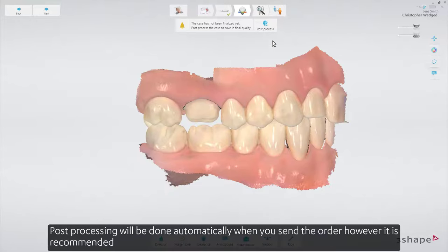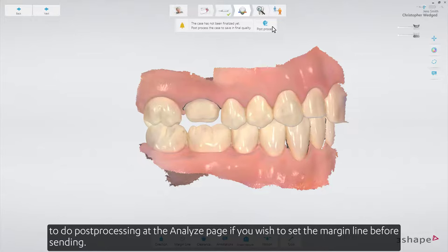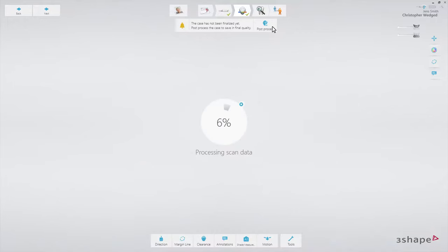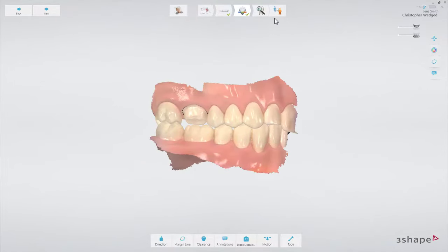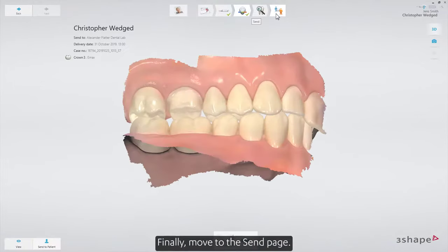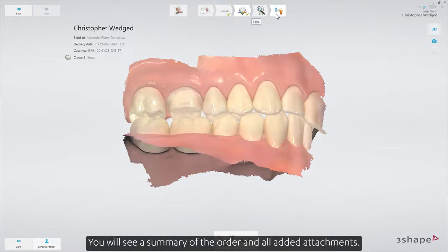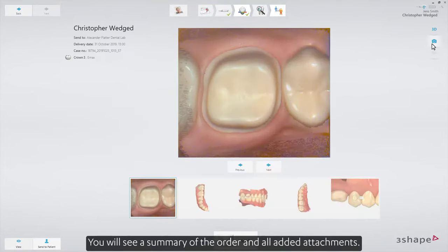Post-processing will be done automatically when you send the order. However, it is recommended to do post-processing at the Analyze page if you want to set the margin line before sending. Finally, move to the send page, where you will see a summary of the order and all added attachments.